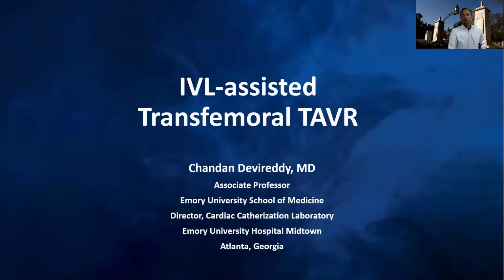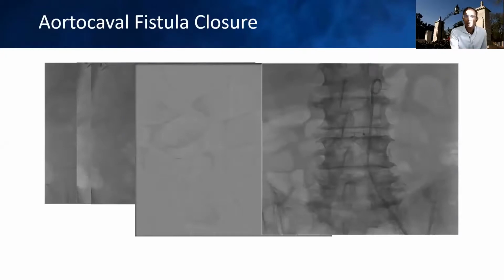So overall, transcaval techniques can be pursued in a way that is safe and predictable. It's the technique in these small steps of knowing how to maintain safety such that there is no bleeding that transpires into the peritoneal space. But if the technique is learned carefully, typically with proctorship in the beginning, this is a technique that can really turn alternative access into more of a routine transfemoral approach.